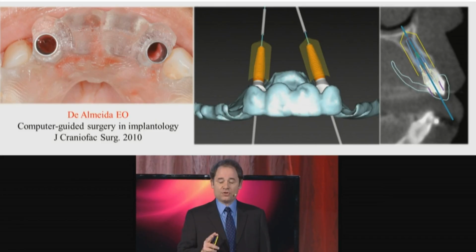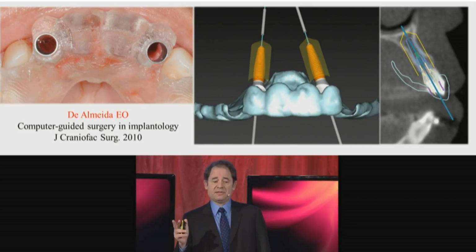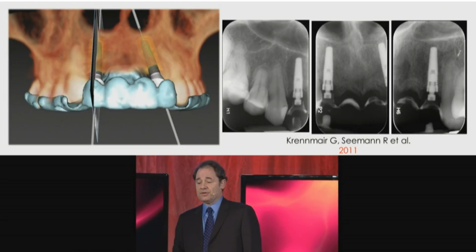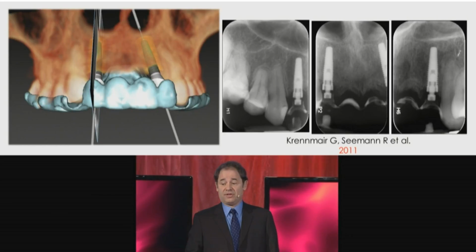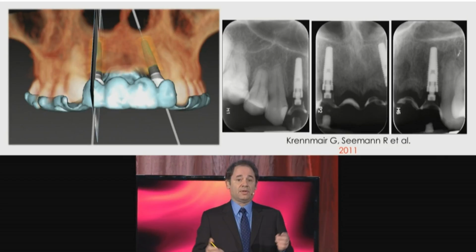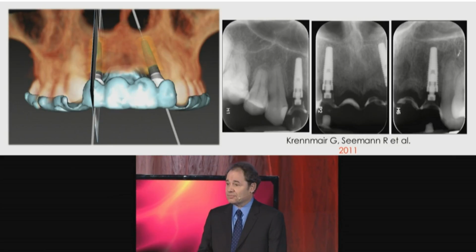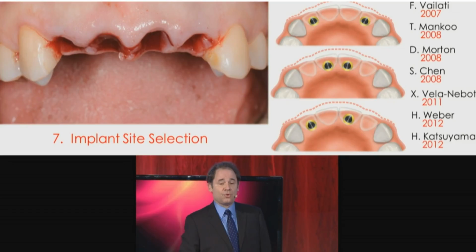And now, selection of implant placements. We selected 2 narrow diameter replace implants in the lateral incisors. So one reason, of course, is the bone availability. How is your site availability? But another reason is that you have a very good study by Krenmeyer, who documented 25 fixed partial dentures of that design with 2 lateral incisors in the maxilla, 2 lateral incisor implants. And he looked at those 25 restorations for 56 months average, plus or minus 10 months. What was the success rate? 100%. 100%. Now, of course, we know that there are many other authors who are thinking otherwise.